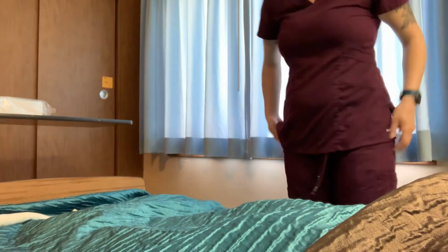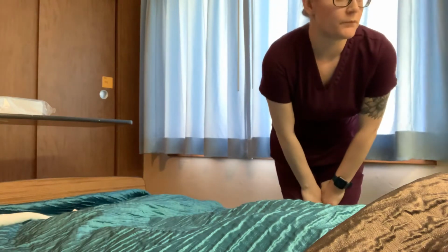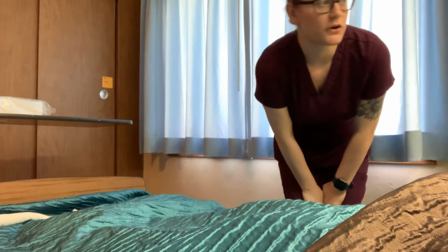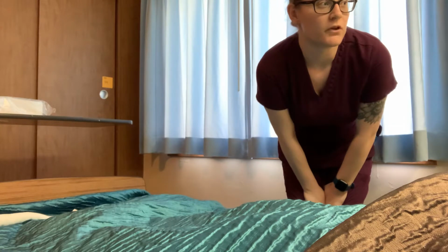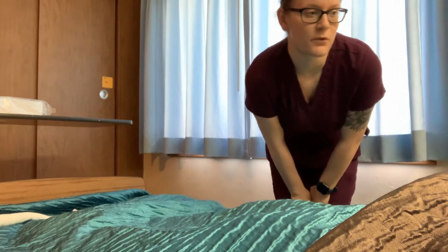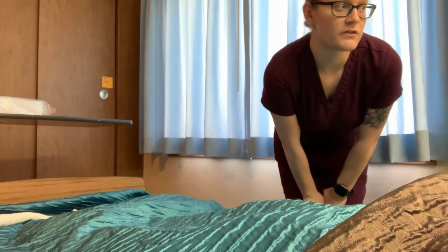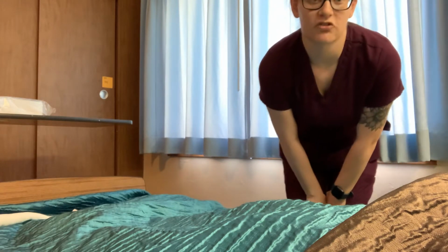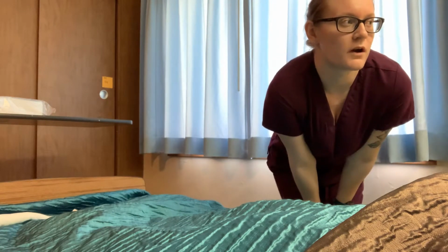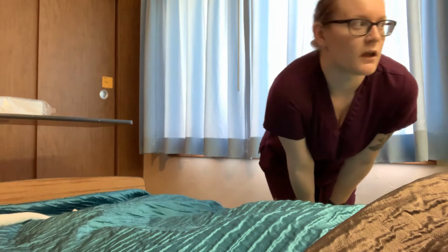Okay, so for a urinary catheter, you want to introduce yourself to your patient. You also want to confirm who the patient is in two different ways, so by name and birth date. Before you start, you want to verify the orders to make sure there are no allergies or specific equipment that you're supposed to be using.